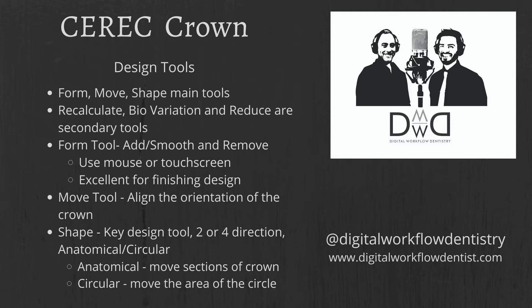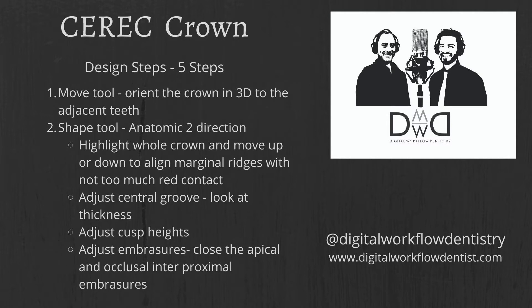I follow a five-step process for my CEREC crowns. Step one is the move tool — sometimes you don't need to do much, but basically you want to orientate your crown in alignment in three dimensions to the adjacent teeth and to the opposing arch. It's a quick 15–20 seconds with the move tool. Step two is the shape tool — go into anatomic two-direction mode.